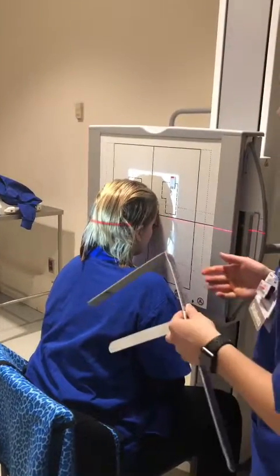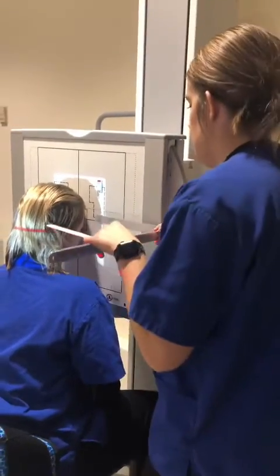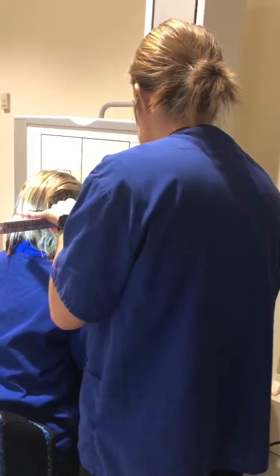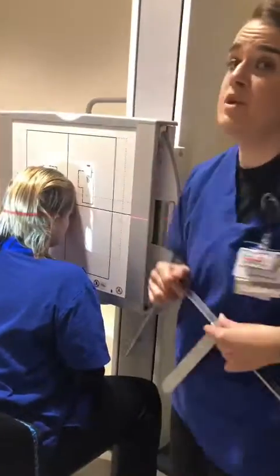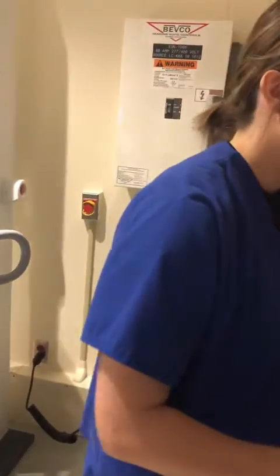And I'm going to measure from where the central ray enters to where it exits. So from the back of her head to her glabella here. And the patient measures 17 centimeters. So I'm going to look at my exposure chart here. And it is going to be at 17 centimeters.